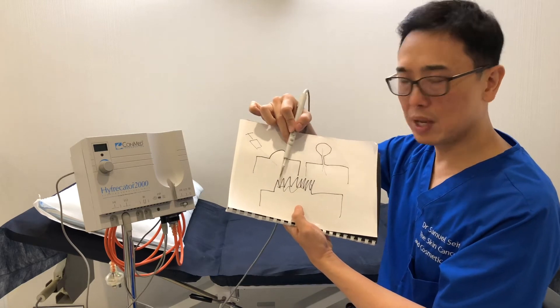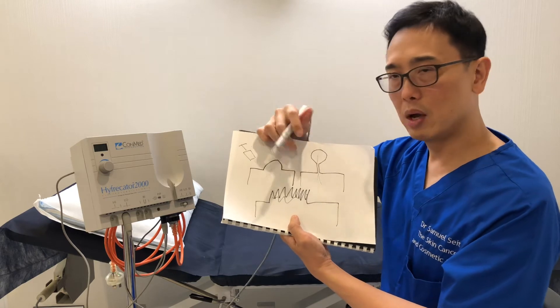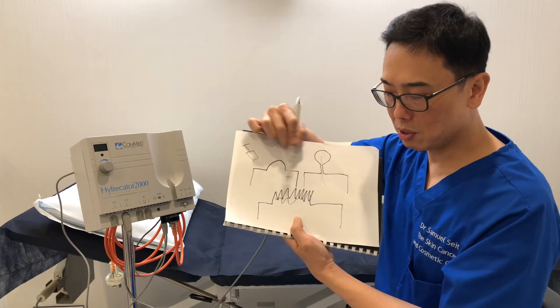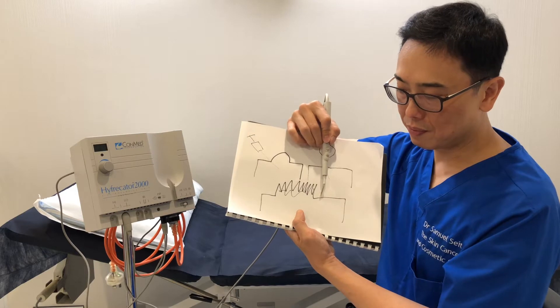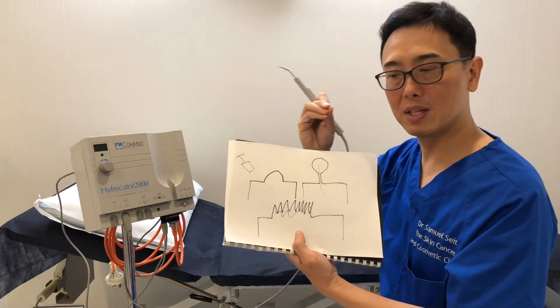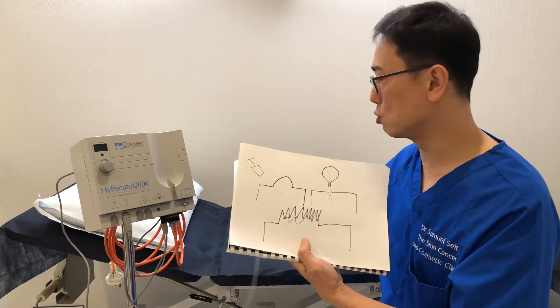For warty lesions, aging warts, seborrheic warts, or even viral warts, we use a smoke evacuator to suck out the plumes. We vaporize the lesion until we reach the flat layer of the skin and then we stop. This also seals the blood vessels. After that, we use a bit of gauze with antiseptic, give it a wipe, and all the scabs come off — it feels nice and smooth.